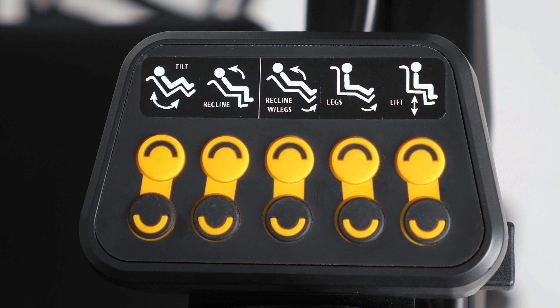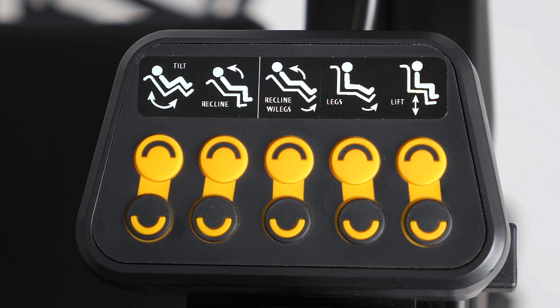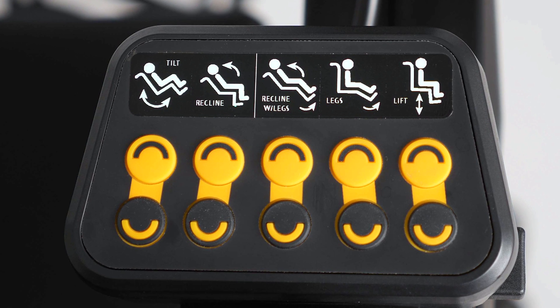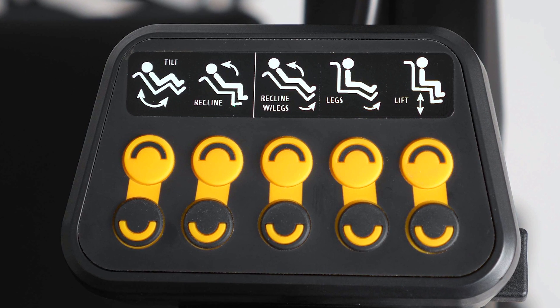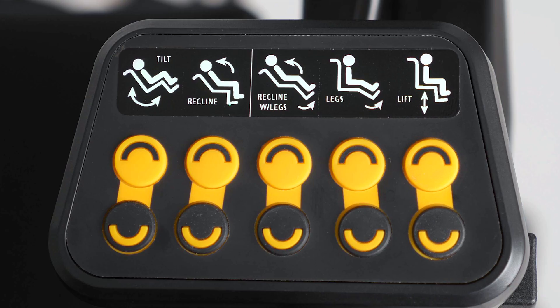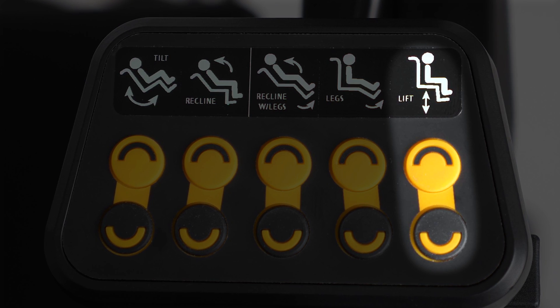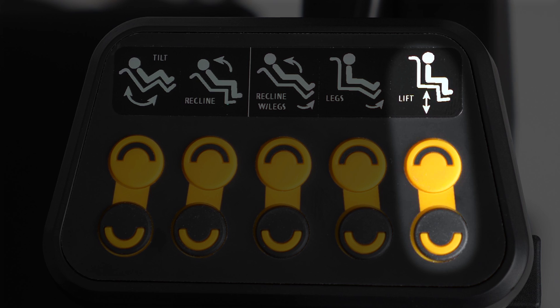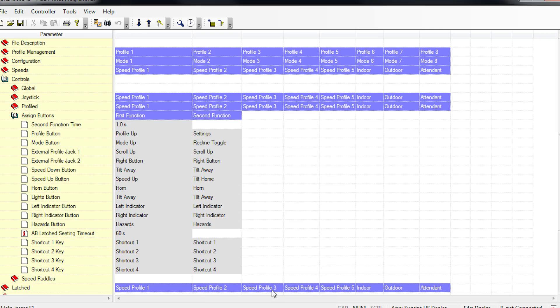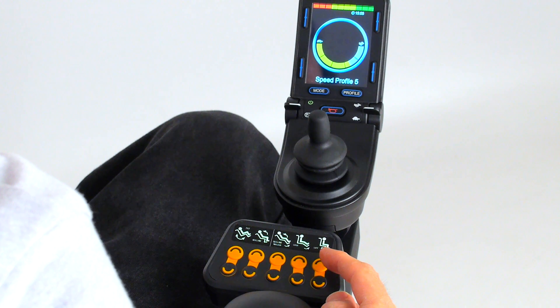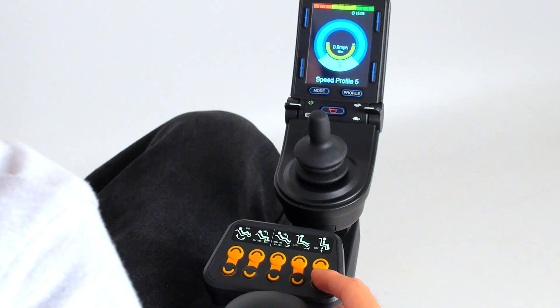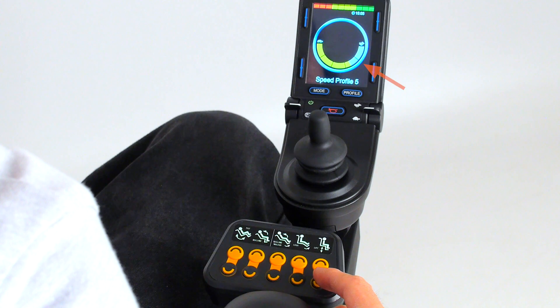But the functionality of the Control-5 does not stop here. Each control button, or toggle switch, is capable of being reprogrammed to a different function. So, for example, the fifth button, which is programmed to activate lift by default, can be reprogrammed to act as a speed switch. Push the upper button and you increase speed. Push the lower button and you decrease speed.